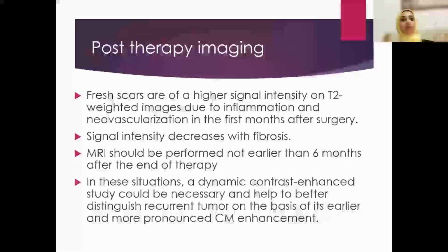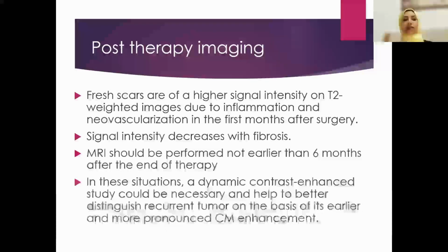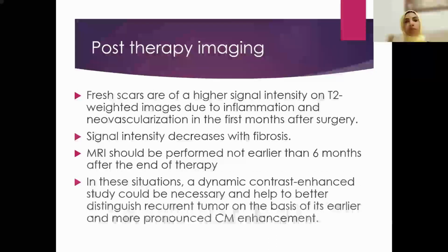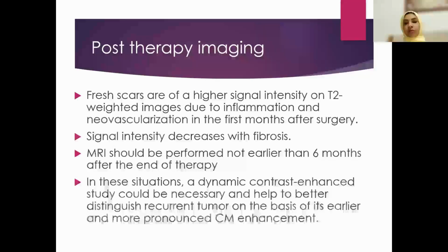That's why we prefer the follow-up to be postponed after 6 months from therapy. However, in some clinical scenarios, it's not always possible. That indicates using other tools, like adding or using diffusion and dynamic post-contrast acquisition to differentiate both.